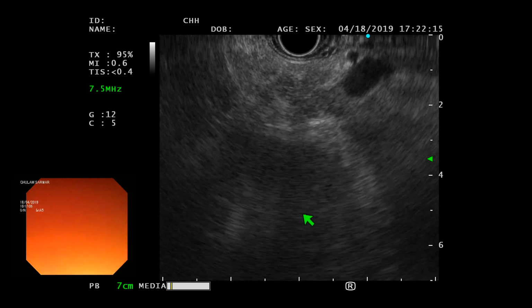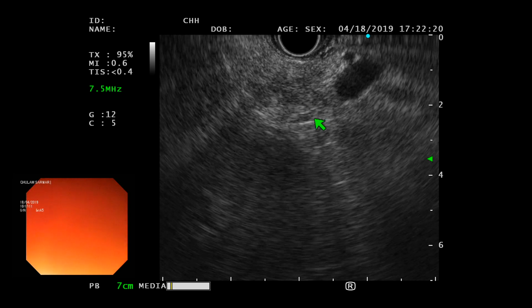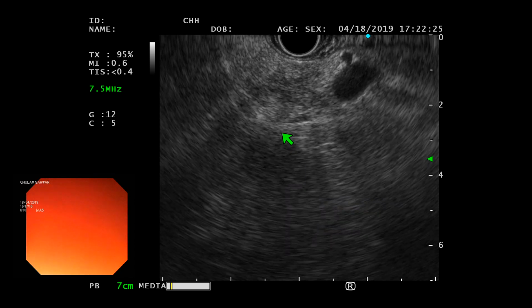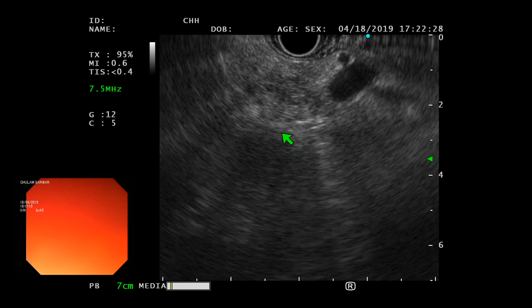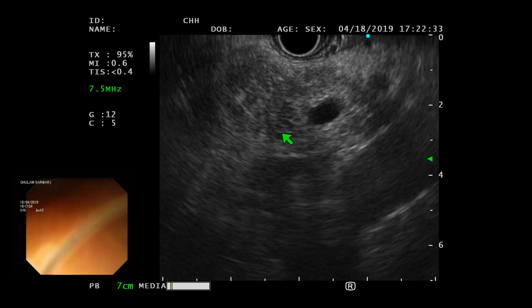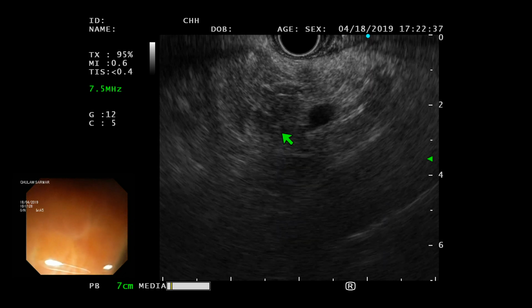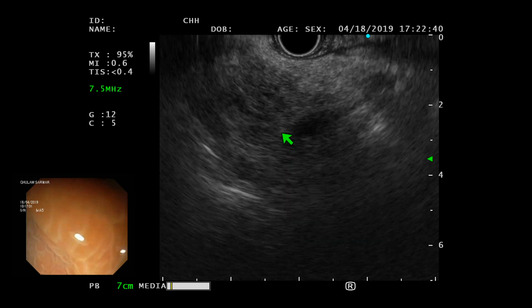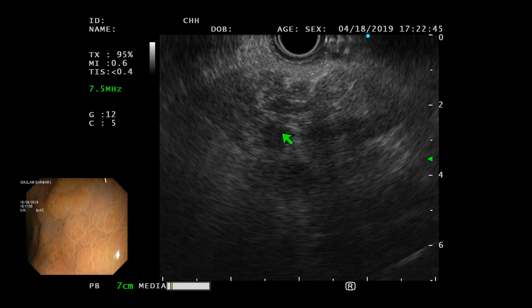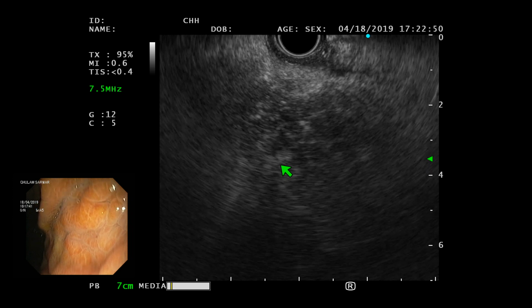And you see the left kidney right here? Yes. Pancreas is here, and we're getting to the splenic hilum right there. So this is the tail of the pancreas. So what you did is you pulled the scope back and rotated it to the right. Now you're going to do the opposite of that. Keep going. Sometimes you have to push, sometimes you have to pull, and other times you have to just use the wheels. Right there, and the duct is now falling into the neck of the pancreas. Perfect.